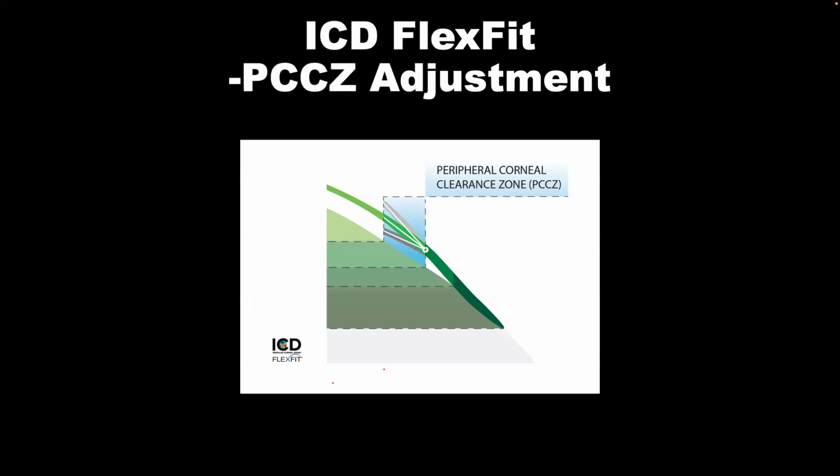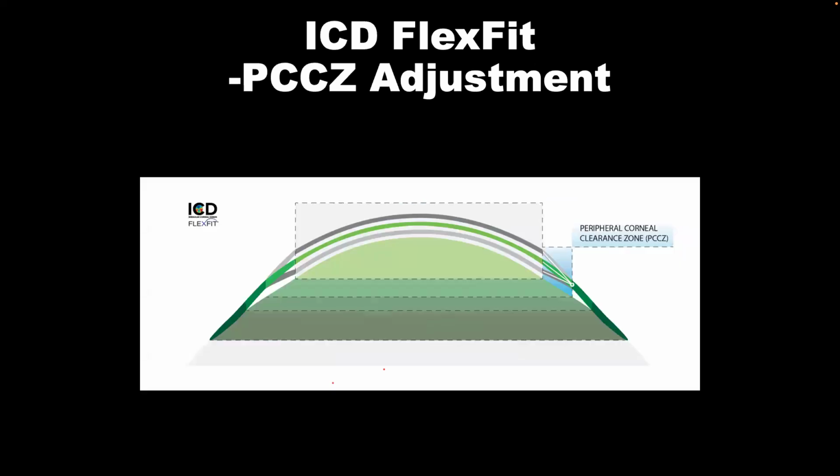And one of the things that Randy, as a designer, suggests here is to try not to go over 8 steps, because if you go over 8 steps, you are changing 200 microns, sorry, at the center. And if you are changing 200 microns at the center, it's probably best to choose another lens.